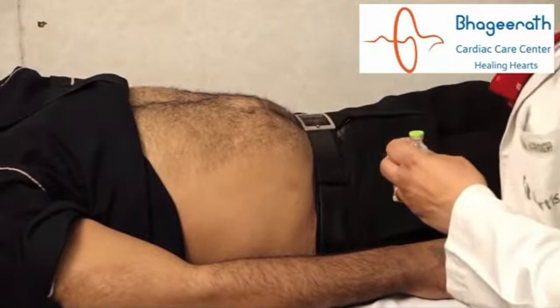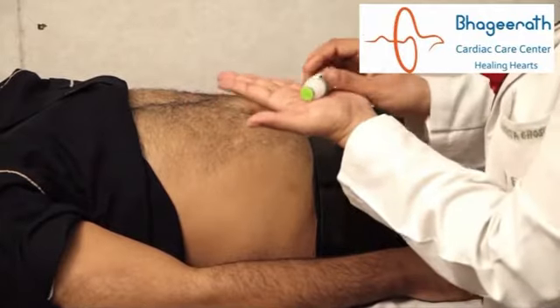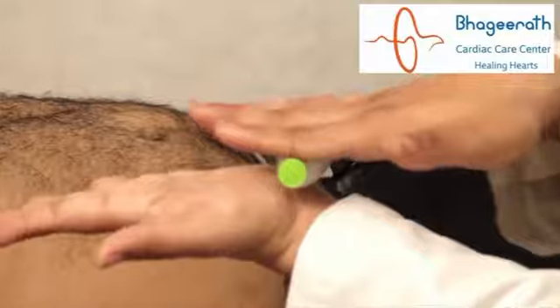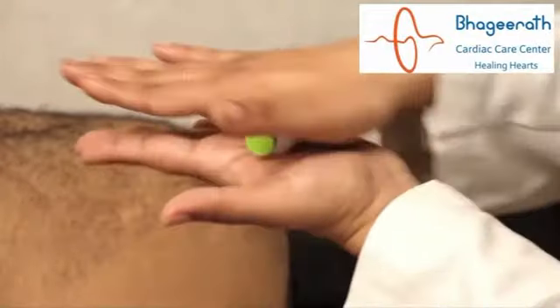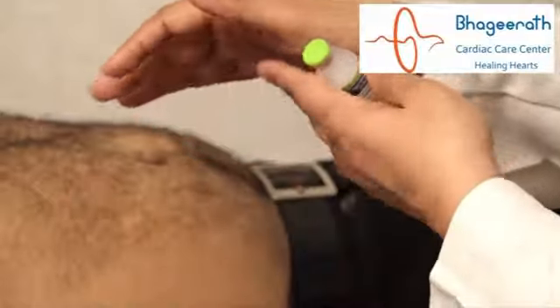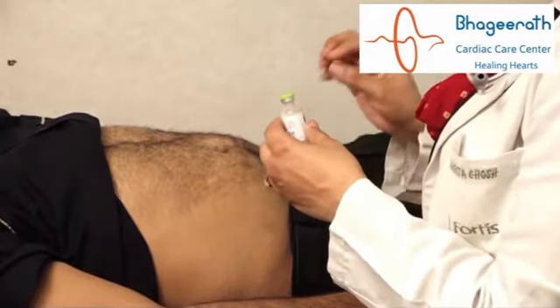Whenever it is a vial, you just tell the patient to roll the vial between their palms and rub it 10 to 15 times. This is much easier for the patient. Make sure the patient does not shake the insulin, because shaking the insulin will reduce its potency.